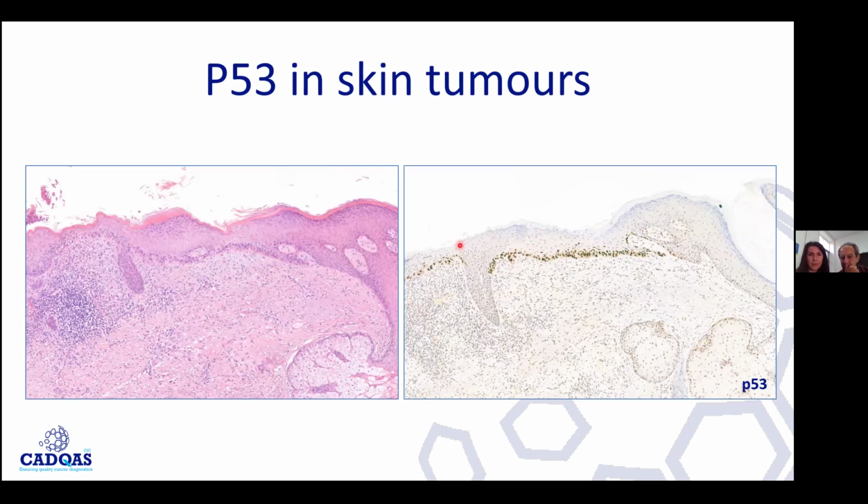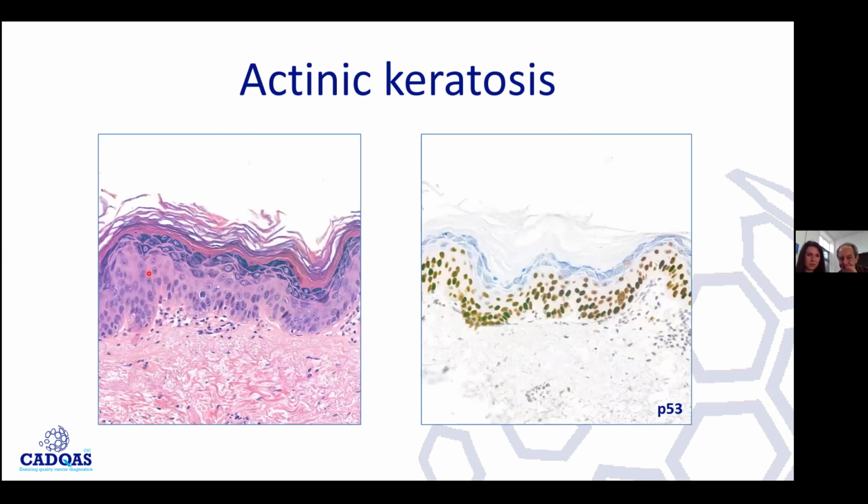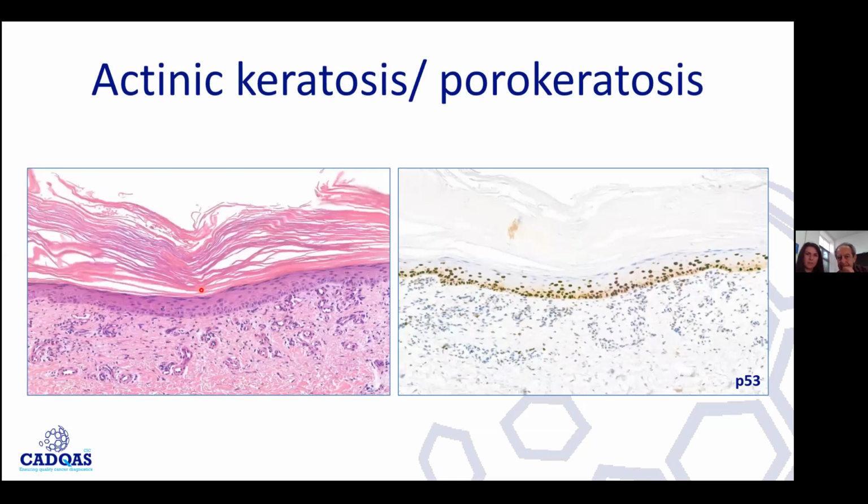It depends on the type of actinic keratosis, whether it's more proliferative, or more conventional like that one. And this one is a bit more subtle. It's almost like you could think, could this be a flat wart with some viral changes? But I think of the P53 expression, and if we look carefully, we see a mitosis here. The cells are enlarged, and I think this could be diagnosed. This is another actinic keratosis. They're both sun damage induced. They have risk of SCC, so it doesn't matter.